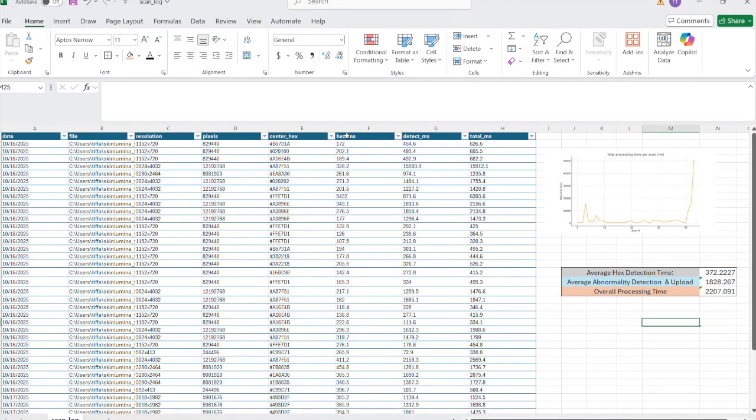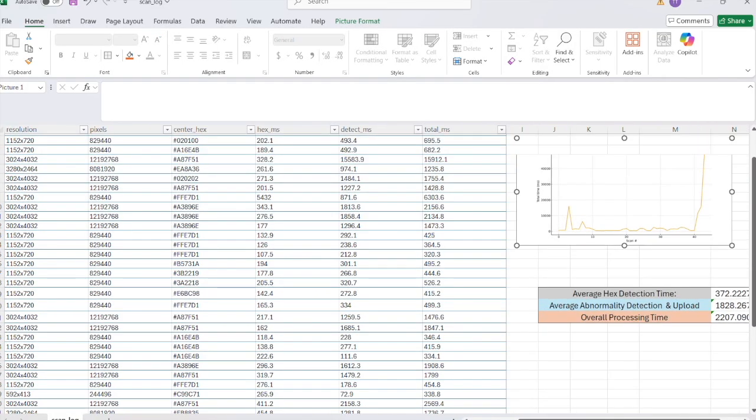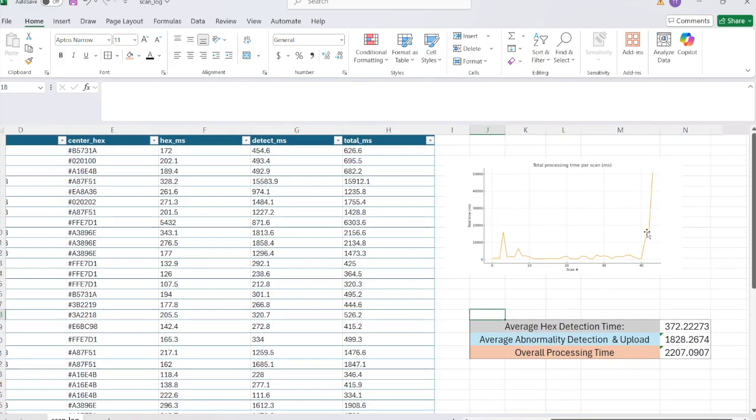So here we have a log containing our metadata. We have different sections. The hex column refers to how long it took to determine the central hex code. The detect column contains both image processing and upload time. That varies with size and also network conditions. So you'll notice a few spikes in that chart. Those aren't errors. That happens when we intentionally switch to a more aggressive detection method to enhance abnormality sensitivity.